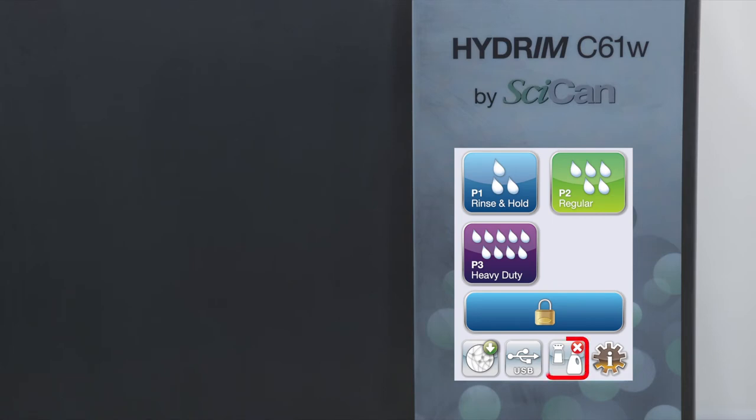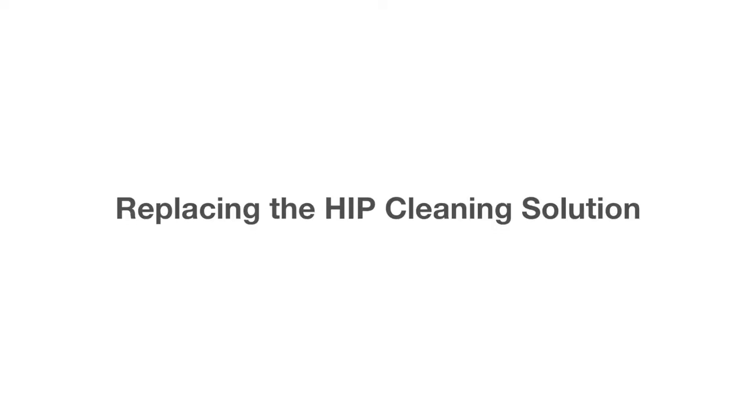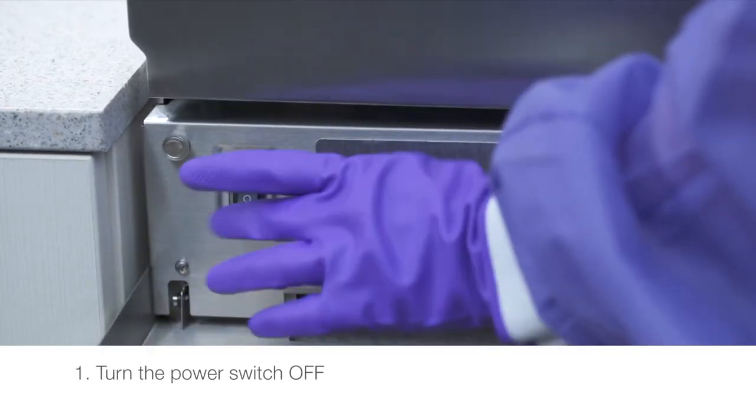Sometimes you might see a red X on one of the icons on the main screen. Press the icon to determine if the HIP cleaning solution needs to be replaced or the water softener refilled. To replace the HIP cleaning solution, turn the power switch off.